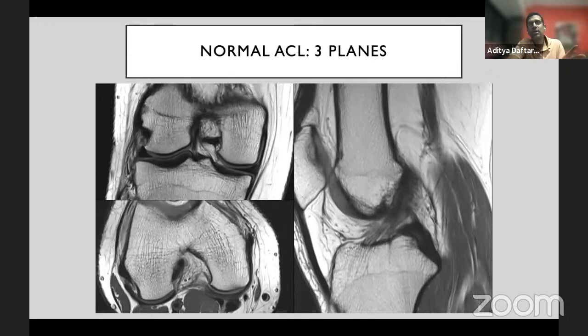We have a simple rule in MRI, which is called there is no free lunch. The moment you start scanning for every individual structure, you just take more and more time on the scanner. And so it is better to learn to work with what we have, and we work actually very well with it, than to do that.